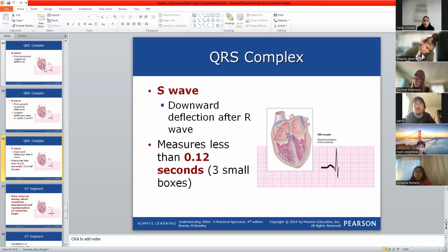The QRS complex, guys, has a fixed number for a normal person, and it measures how much. Can you read this for me, Aaron? This is the normal value of the QRS. What is the time? Value of QRS. 0.12 seconds. Say it again. No, read it correctly. The measure is less than 0.12 seconds. Less. Very good. So why am I asking you to repeat? Because it should be less. Take care.